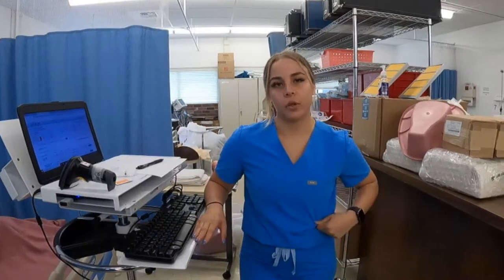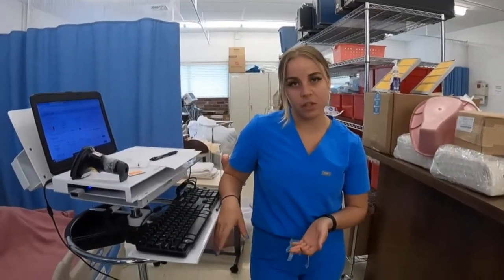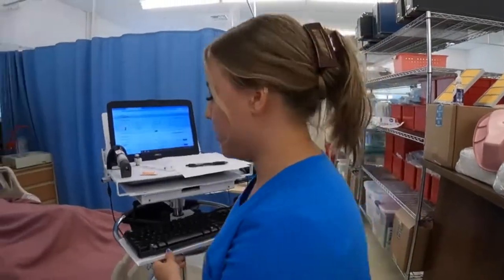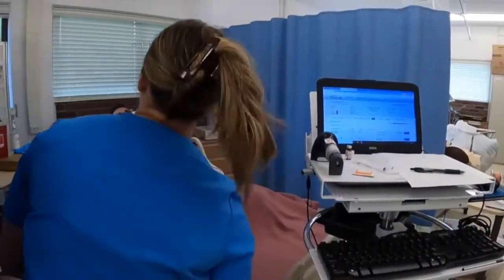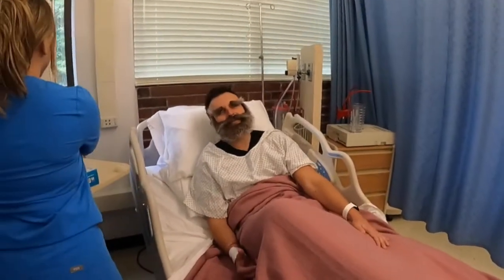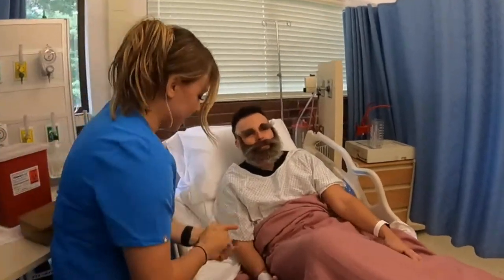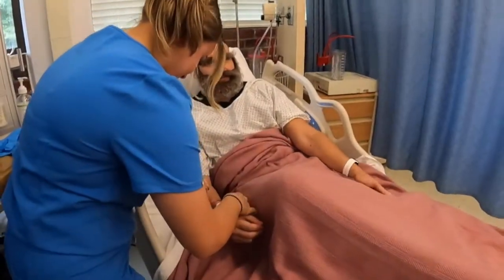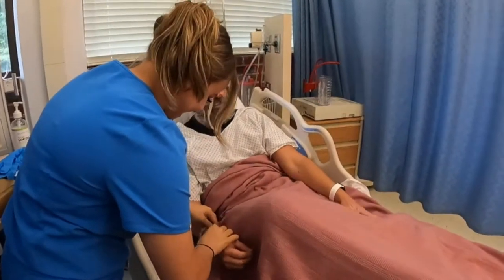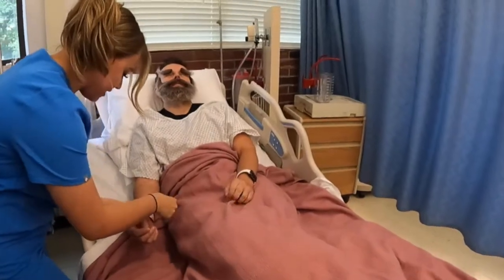Now that we've done our first check and pulled the medication, I'm going to introduce myself to the patient and verify their name and date of birth. Hi, I'm Sophia, I'm going to be your nurse today. I'm here to administer some medication. Can I have you verify your name and date of birth for me? Morgan Ward, 6/17/XX. It looks like you have an allergy to iodine and shellfish — is that correct?